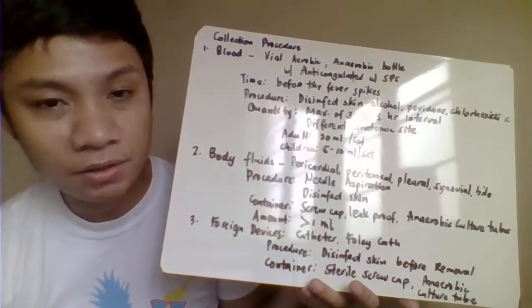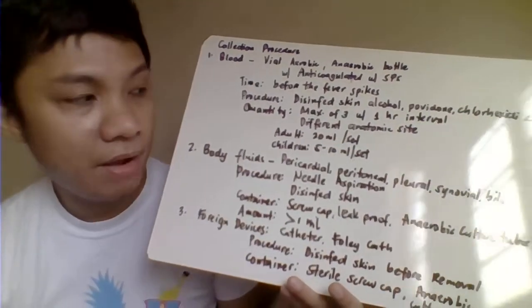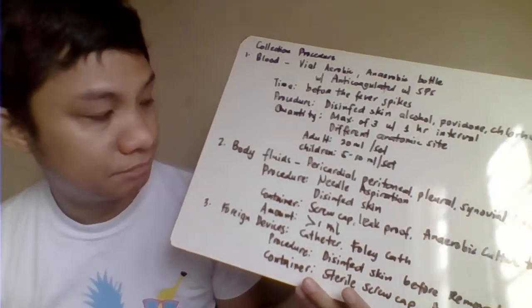Okay, for the adult, most likely ang lagayan is 20 ml. And for the children, we have here 5 to 10 ml per set.